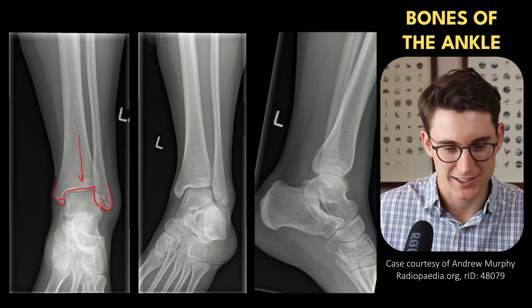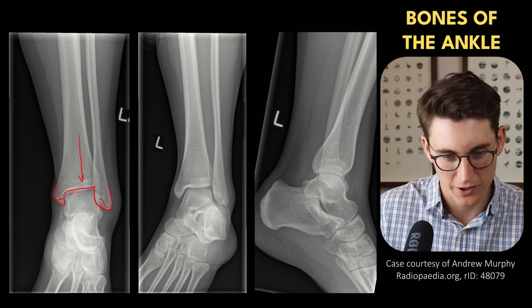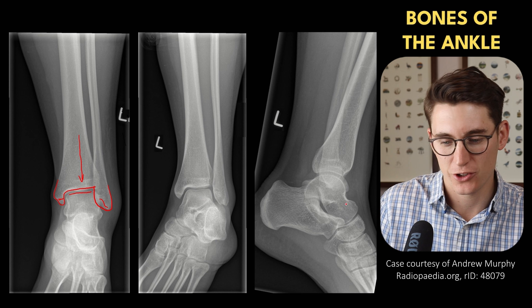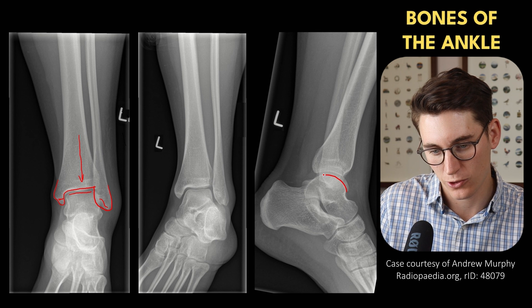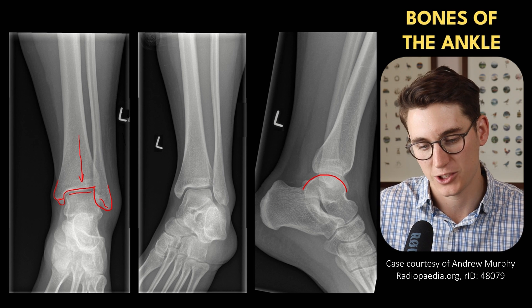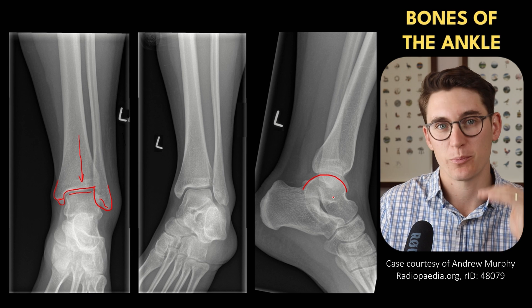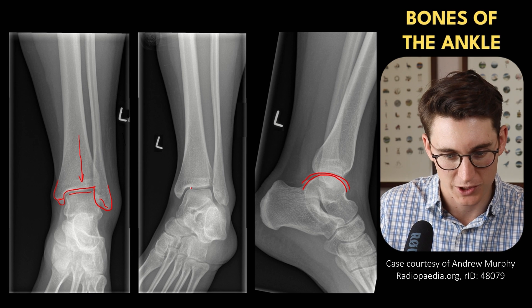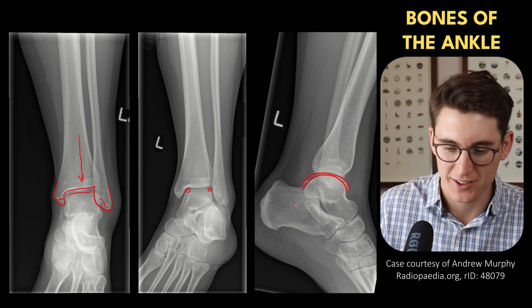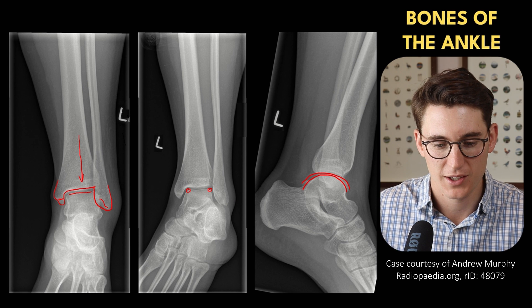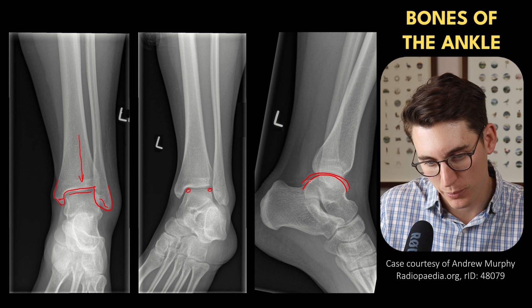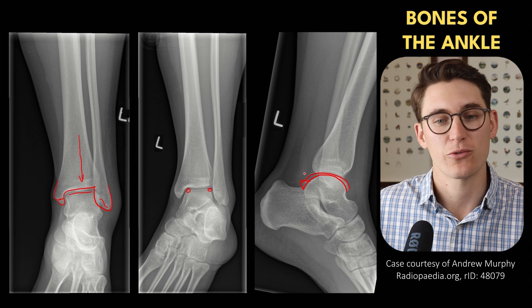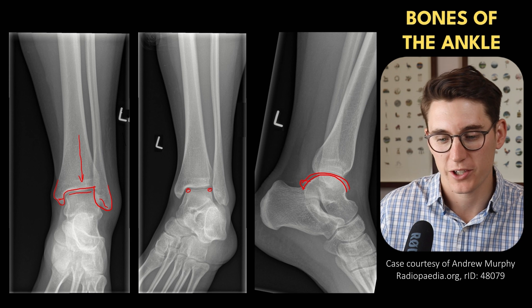If we have a look at the talus itself, we can see the superior surface of the talus — what's known as the talus dome. We can see this dome shape on our lateral view of the talus. We haven't actually caught this talus in pure lateral view because we can see both the medial and the lateral domes here. The talus has a posterior process, and sometimes that posterior process is separate from the talus — that's what's known as an os trigonum.